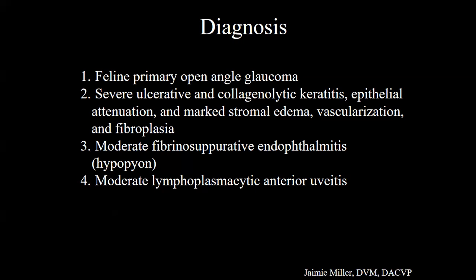Blame the herpes virus. So what would your differential be for that gross appearance? Obviously, this is granulation tissue. For those of us in the room, I don't expect a corneal granulation tissue to be my primary process here. Neoplastic. There could be a couple of neoplastic differentials for a corneal mass.